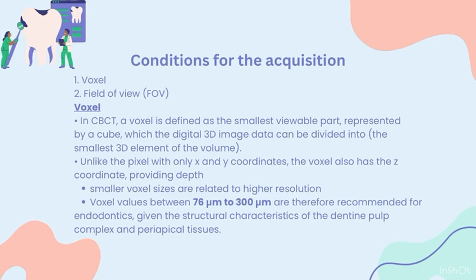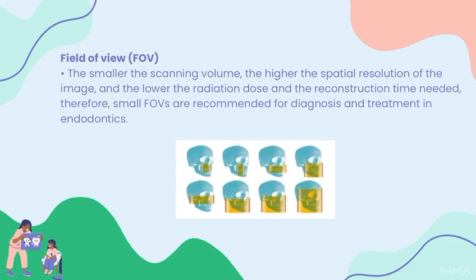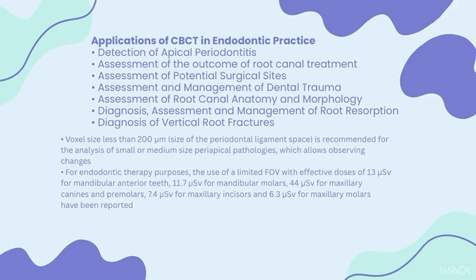Field of view. The smaller the scanning volume, the higher the spatial resolution of the image and the lower the radiation dose and the reconstruction time needed. Therefore, small FOVs are recommended for diagnosis and treatment in endodontics. Applications of CBCT in endodontic practice are as follows.